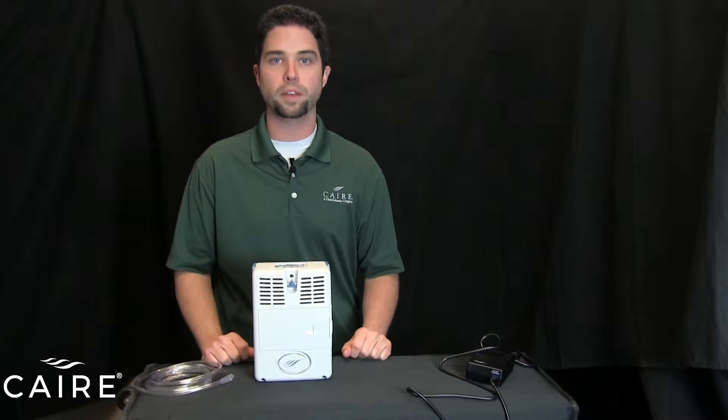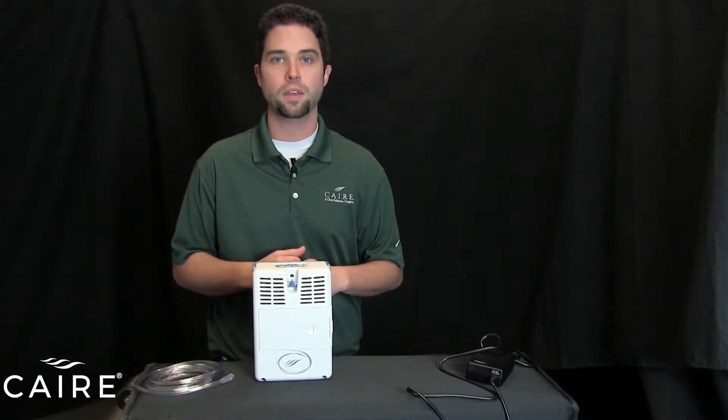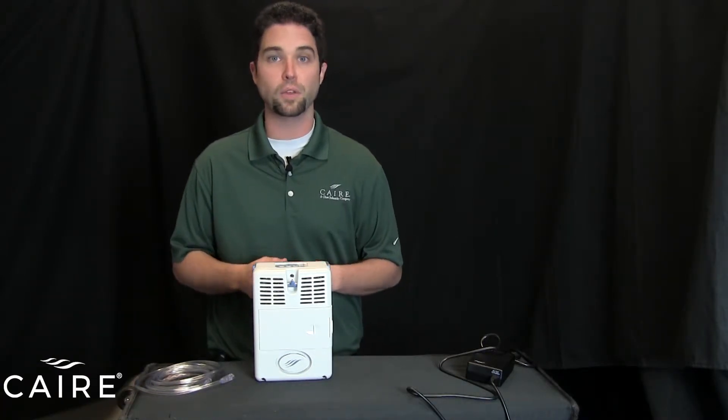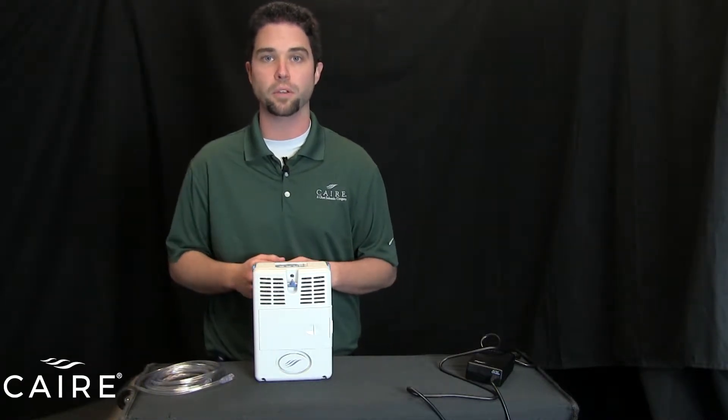First thing you want to do is make sure that your battery is fully charged and installed before you go out and about. For the purpose of this video, the battery is already charged and installed inside the unit. If you need information on how to do that, please reference our out of the box video also on our YouTube channel.